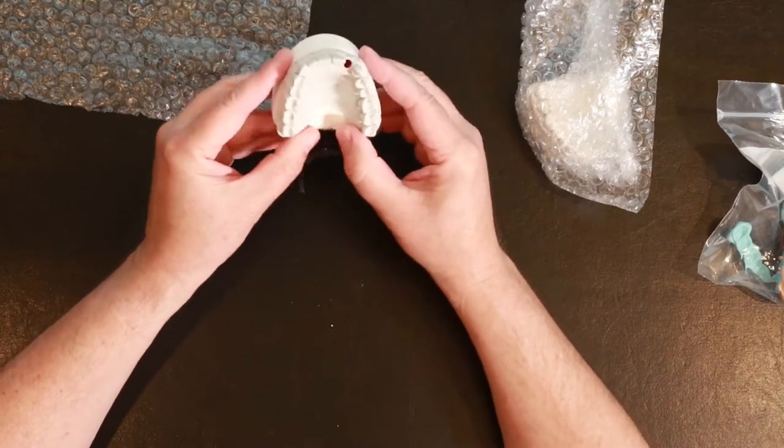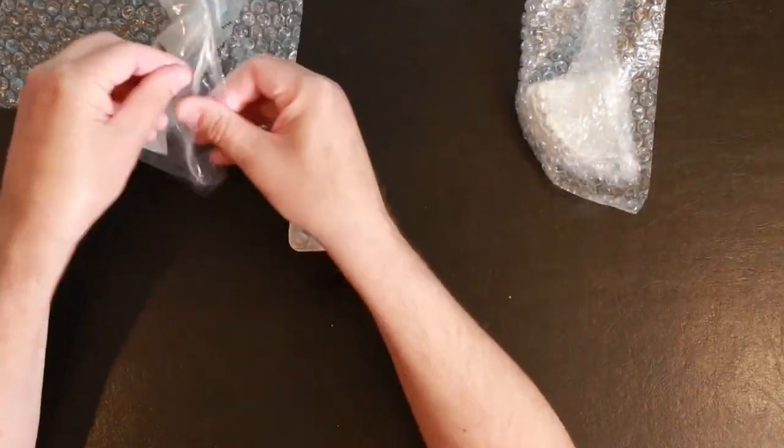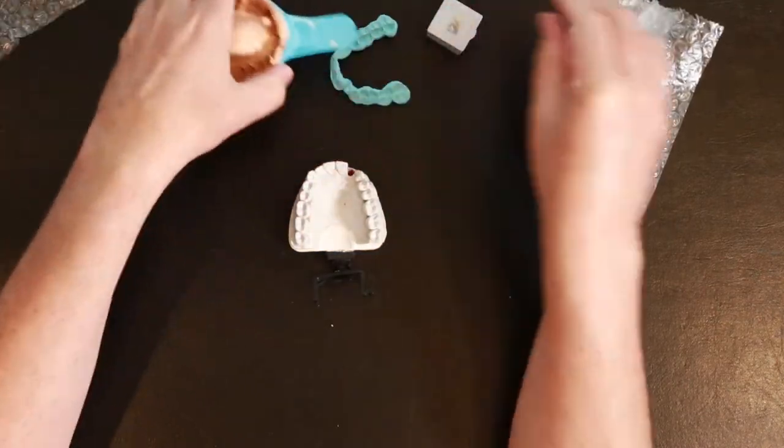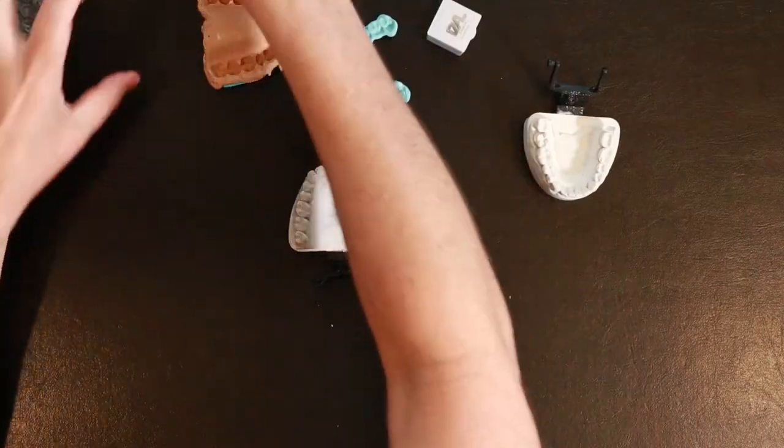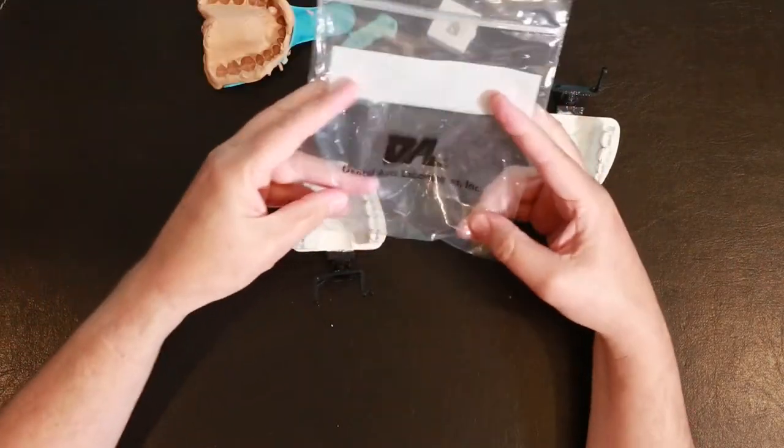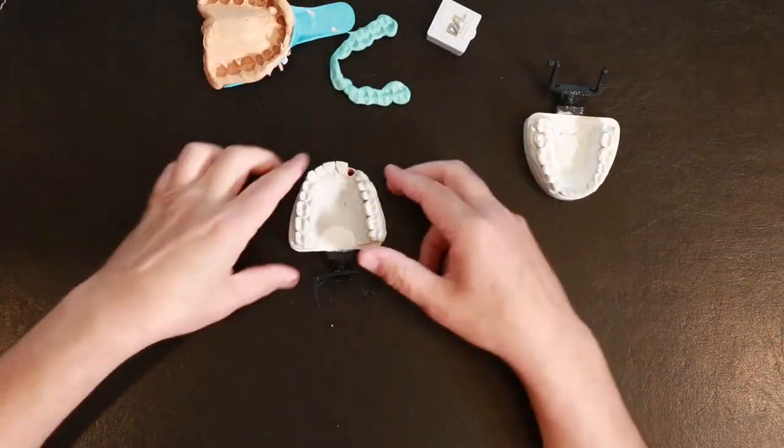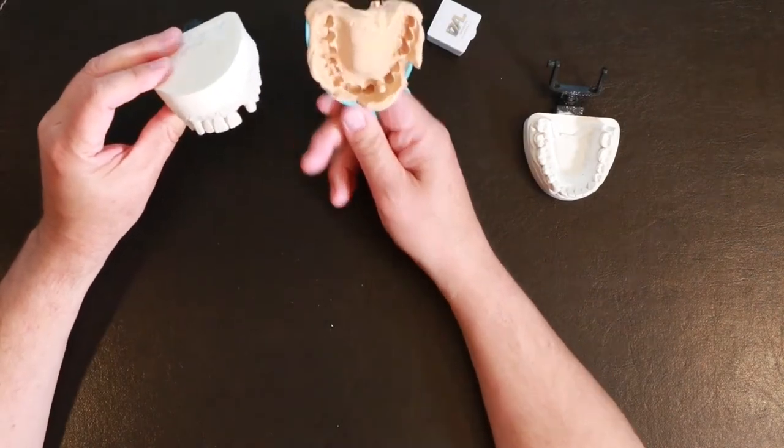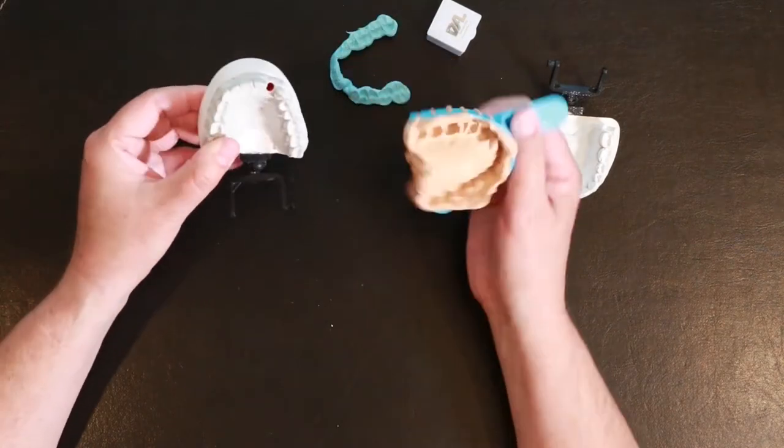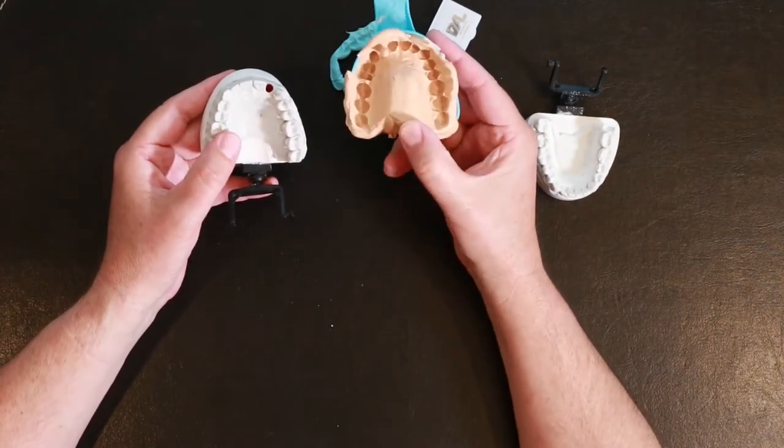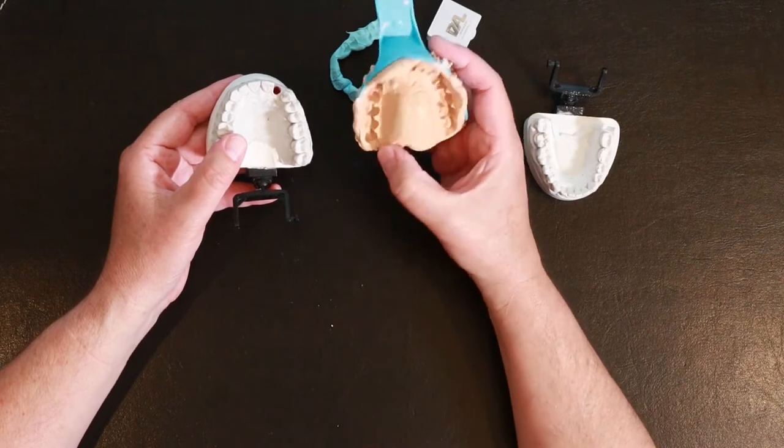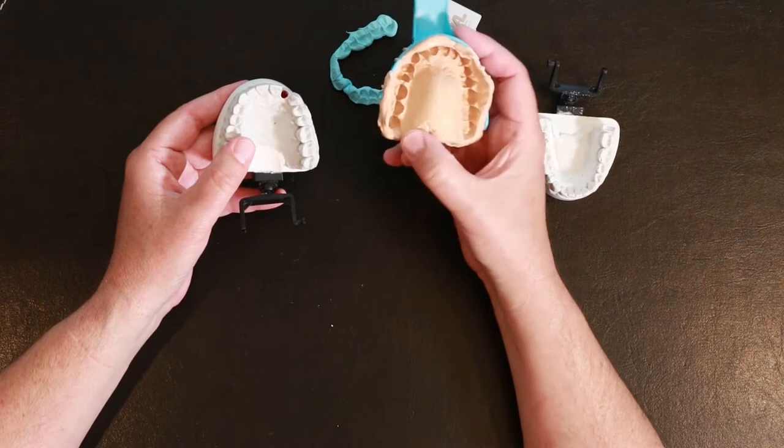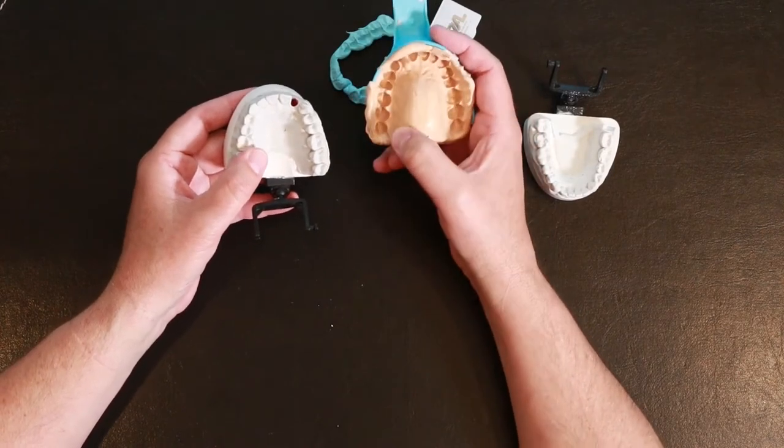This is the upper model, this is the model that they made based off of this impression that I sent. I took this earlier. You can rewind and see how I made that or if you're watching my unboxing video check out my steps in making a Maryland bridge video.